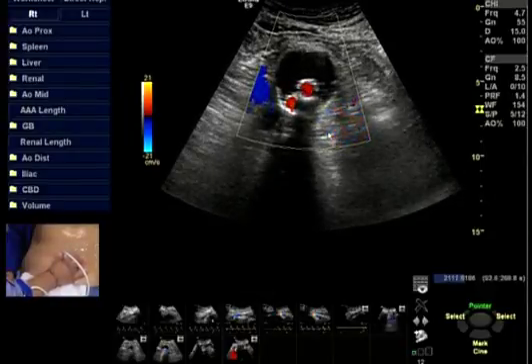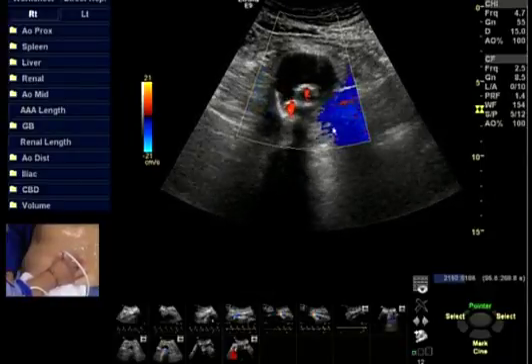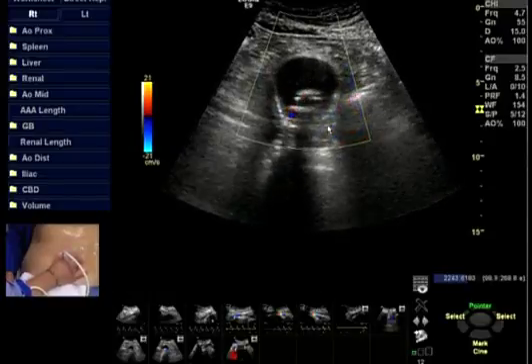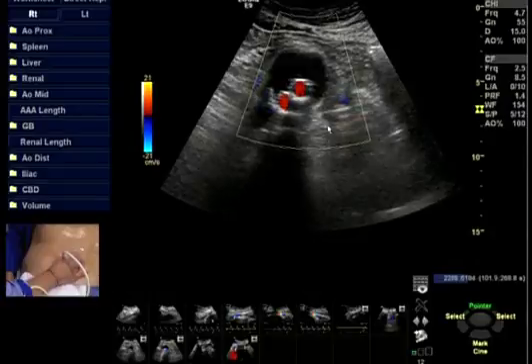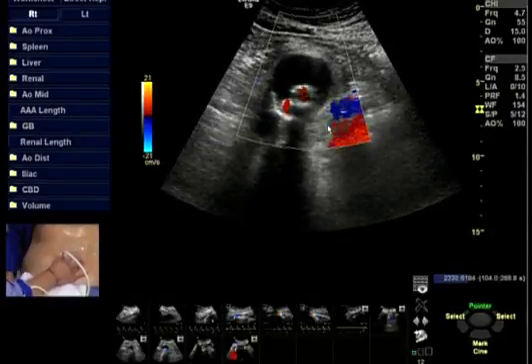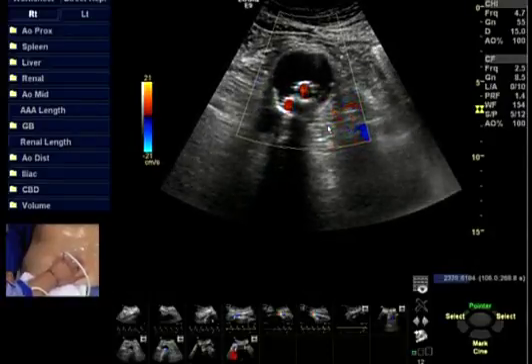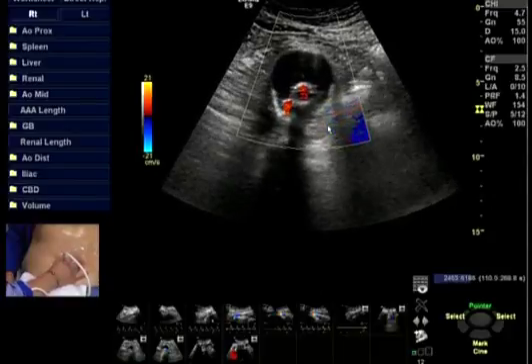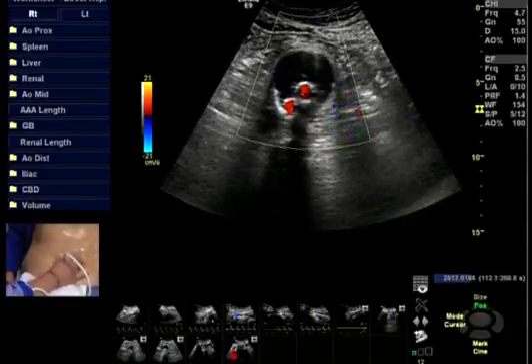So in the aortoiliac examination, you may once in a while want to have the patient hold their breath or stop breathing, but typically it's not necessary during this examination. That's one of the nice features of this because, again, the vessels are large and fairly fixed in place, and you haven't seen a lot of respiratory variations and changes as we go throughout the study.